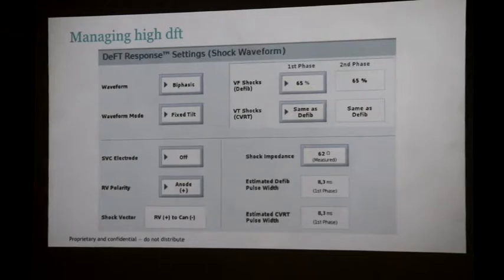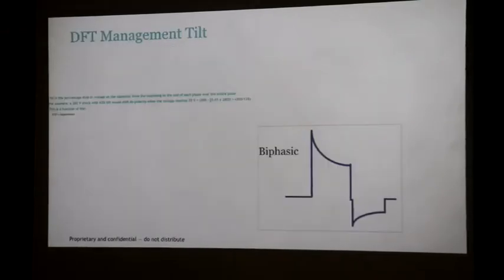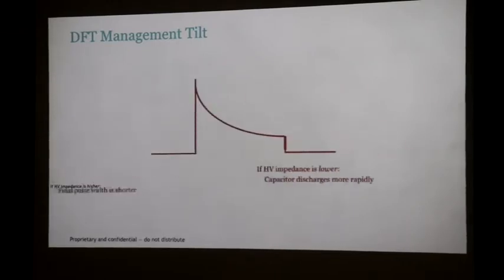Anyway, no, you're making a lot of sense. Boston, Medtronic devices are cathodal. So yeah, but that's up to them. All right, so let's move through here.